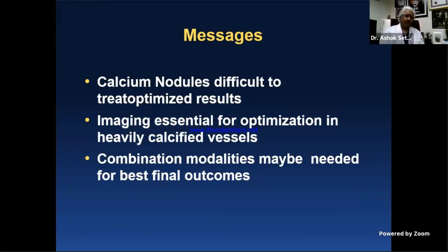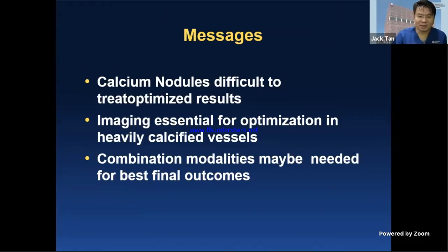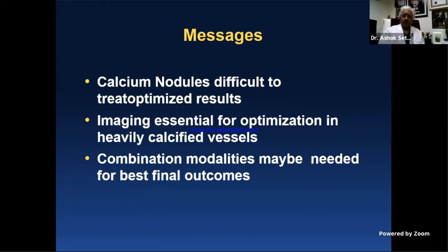75 degrees, we go around 90 degrees, but we have to take small burrs, ease it out, ease it across, and make sure that we will on occasions go through a media, but we shouldn't go through the adventitia. That's the main thing. Stop when you feel it's, go with a balloon. So you don't have to take a burr through and through the lesion. Do half ways because the rest can be tackled with a balloon.